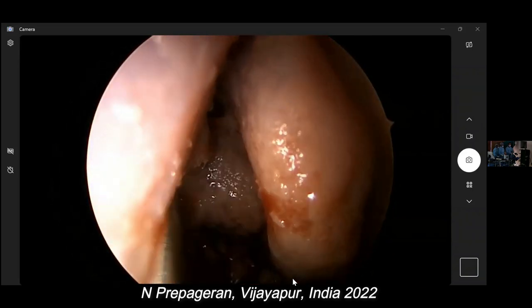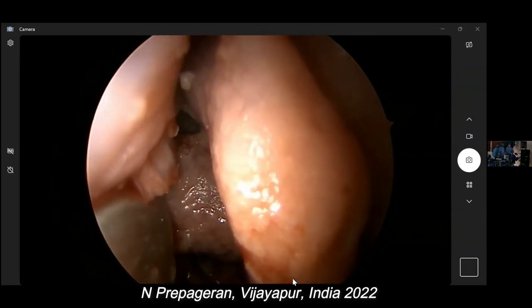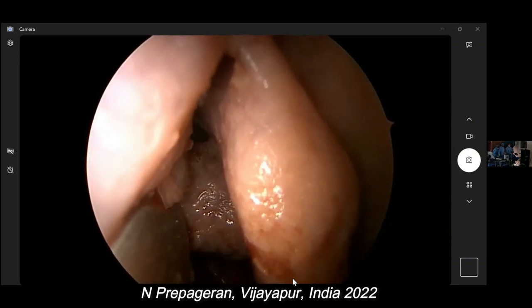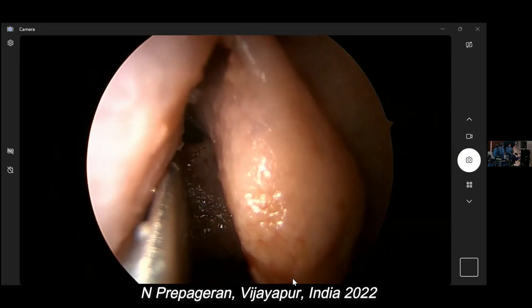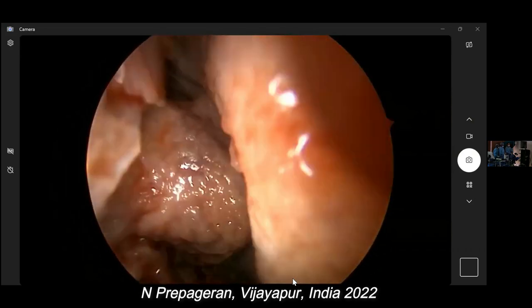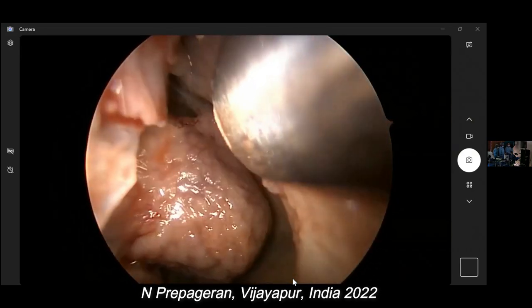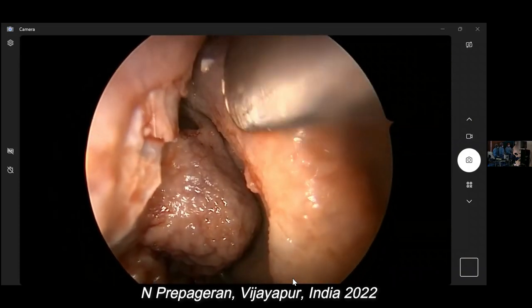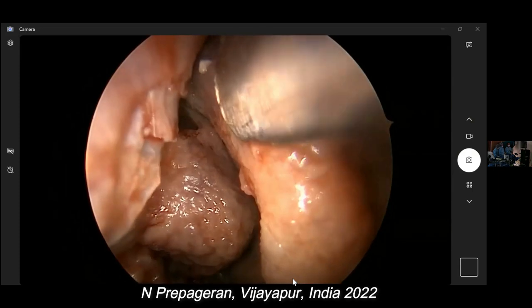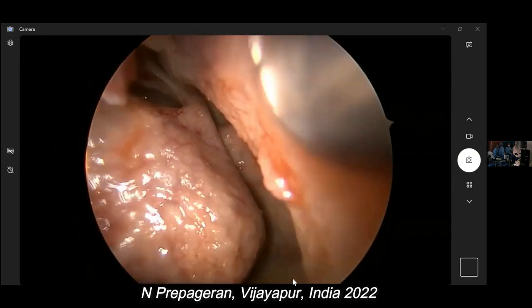Always keep a little bit at the upper part of the uncinate because that's your landmark for the frontal. So your uncinate will always give you a vertical shelf backwards. And depending on the attachment of the uncinate process, whether it's to the middle turbinate or into the skull base or the orbit, you will know the opening of your frontal recess.